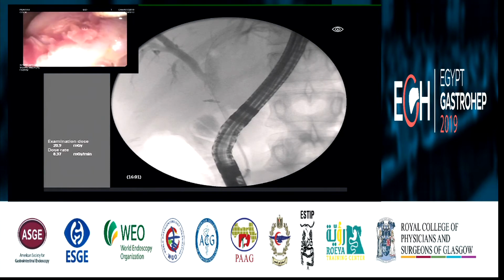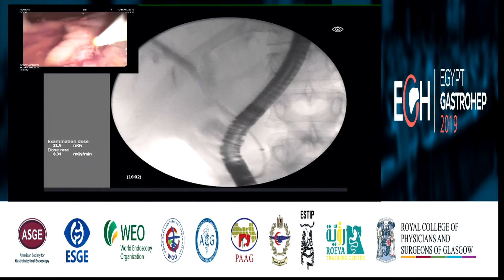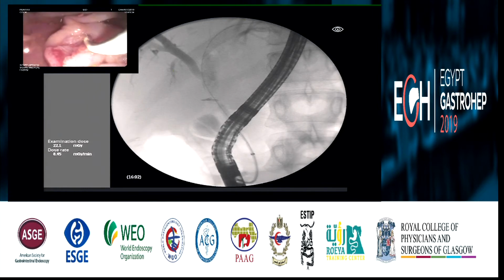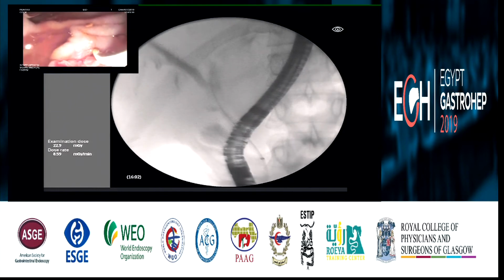Push the wire, please. Push. Okay, I won't pass through the papilla. I don't want to traumatize. So, please inject some contrast. Now we will inject under pressure just to see. I think it's below the confluence, right? Below the confluence, yes.